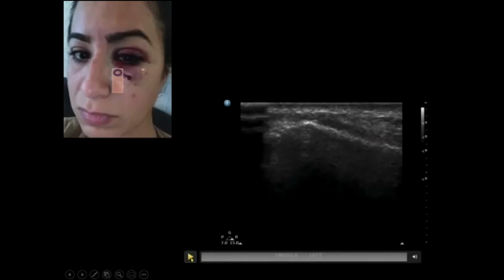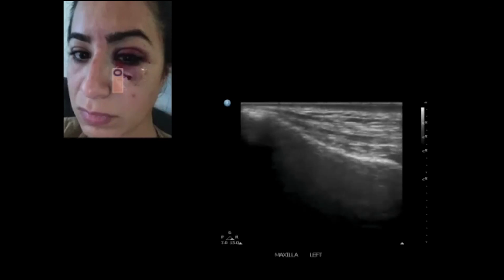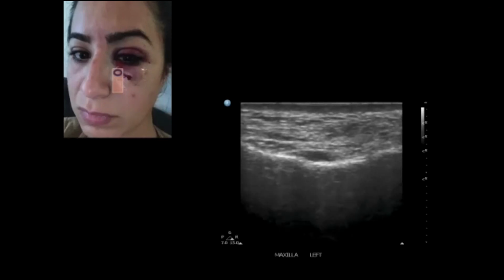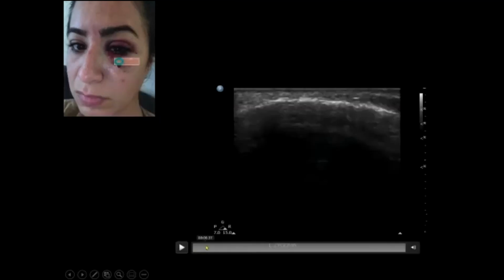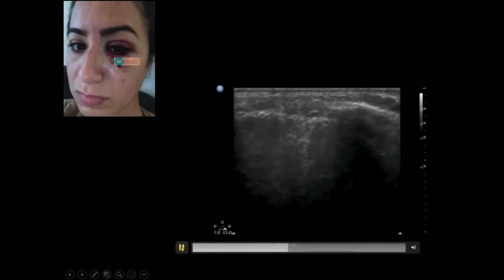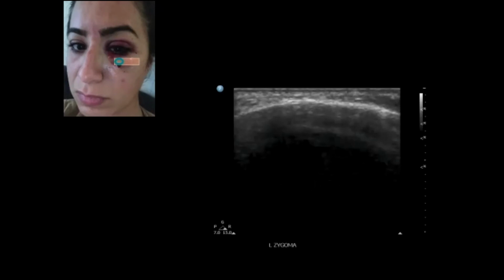And this again is in the sagittal view. And going down the maxilla, you almost don't see this little tiny fracture, but here you do see that periosteal lift. It's a little better seen. So this is actually going from superior to inferior with the transducer in the transverse orientation. And we actually get a little bit of a step off where that fracture is.